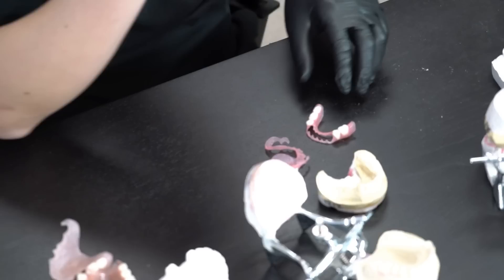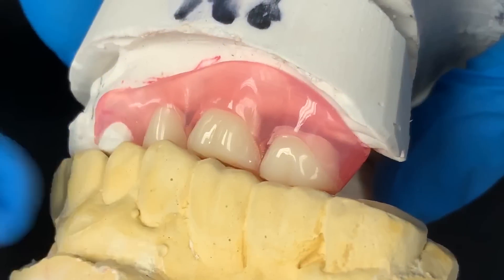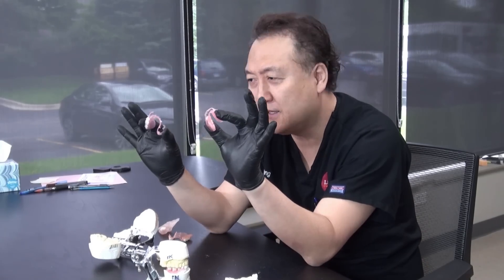What is the best flexible partial for our patient? I have four live cases today. Why am I excited? Because look at this slim design — it's very sexy, it's flexible, it's really thin.